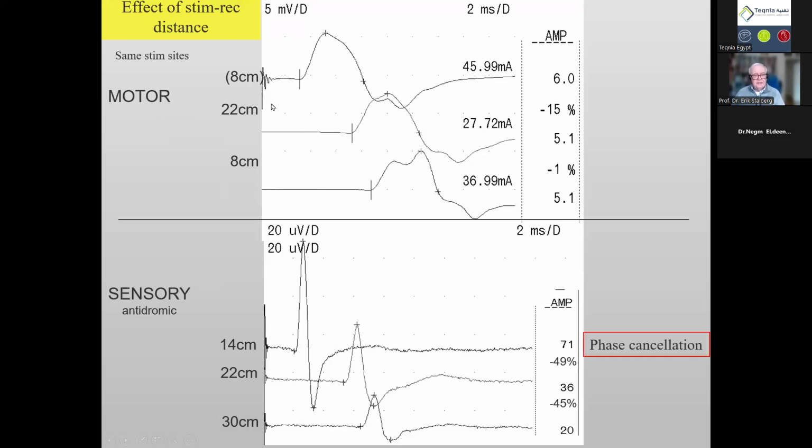Another thing is that, as you know, the distance between stimulation and recording will give different shape of the response. Not so much for motor.